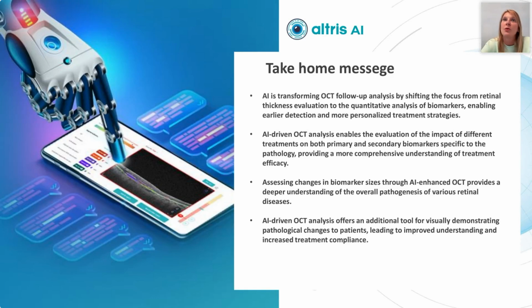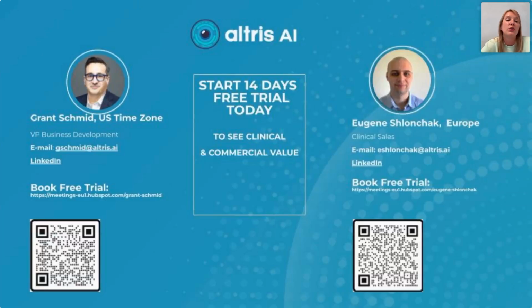And also overall, we can understand better the pathogenesis of various retinal diseases, and AI can see really a little bit more than we used to have in our OCT devices. So basically, we can use it today. Altris AI has FDA clearance, CE certification for the European Union, and it is already used in many practices, in optometry practices, in ophthalmic clinics as well.